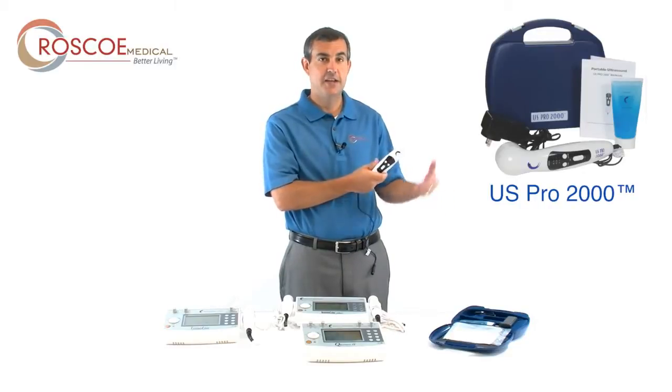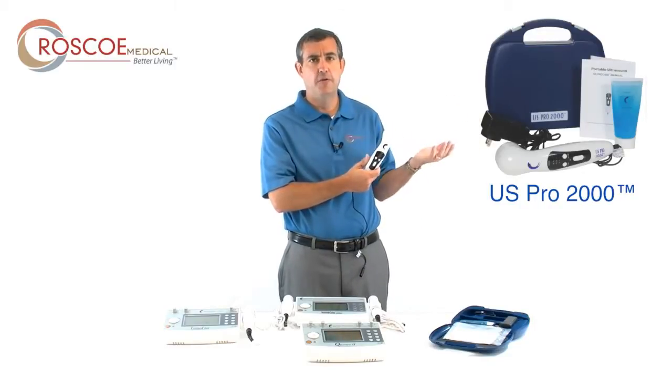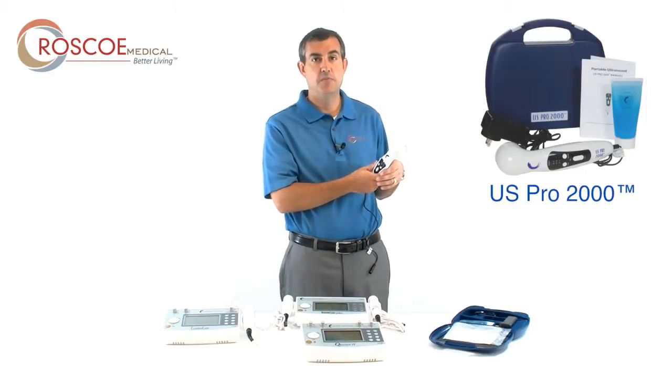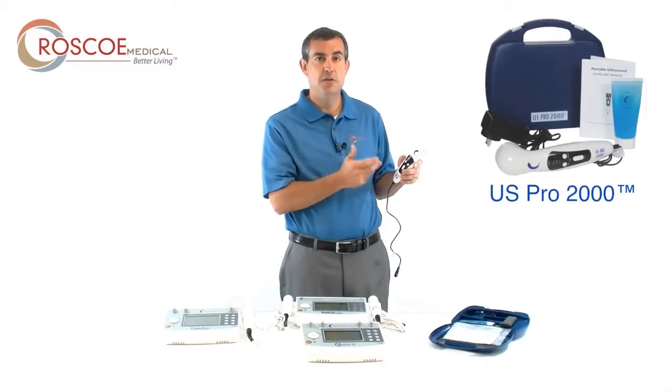It comes with a carrying case and is extremely portable. It's great for use when you're on the go — whether you're an athletic trainer going between fields, or a clinician going between offices or patients' homes. That's the US Pro 2000, and it's part of our clinical lineup.